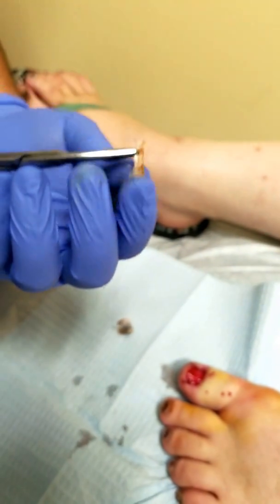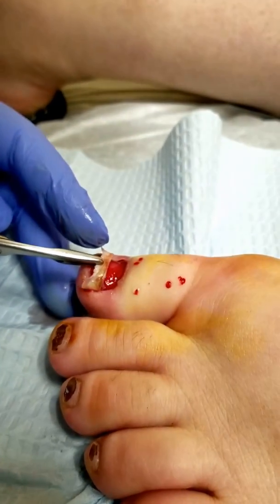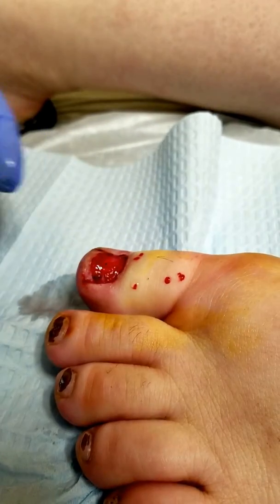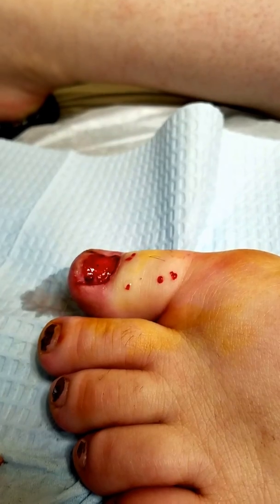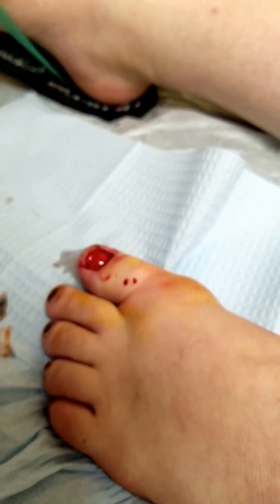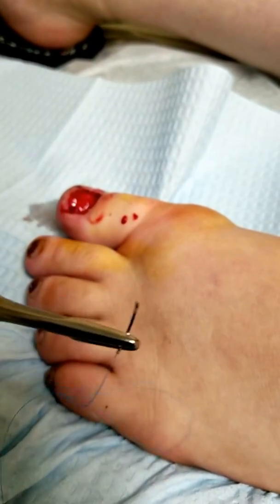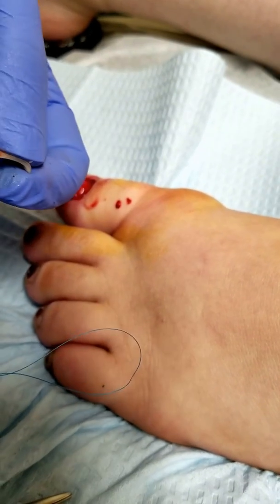And then we'll go from there. I can feel that — kind of. Yeah, you're still going to feel a little bit of pain and pressure. We'll go from there. So, let's begin.